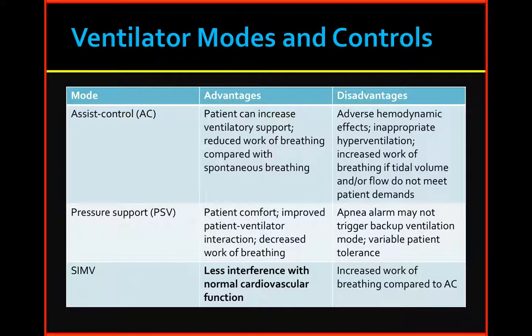With SIMV mode there's less interference with normal cardiovascular function, so it's more common in cardiac surgery. You can see why a lot of cardiac surgery places like SIMV. It has to do with the hemodynamics of the patient, and there are fewer problems with that. And you all understand what the assist control and SIMV are on that graph now.